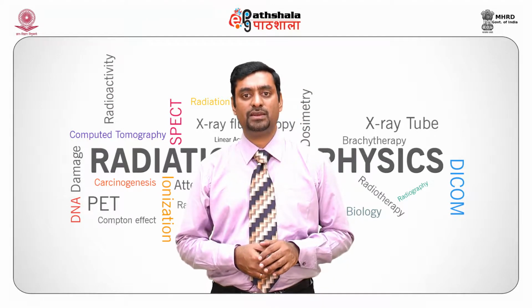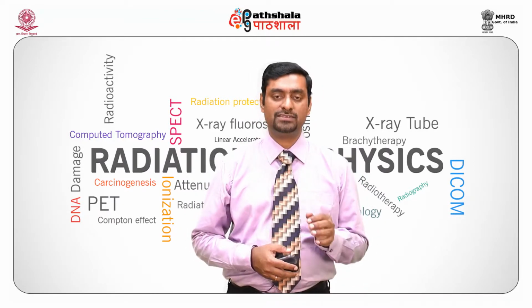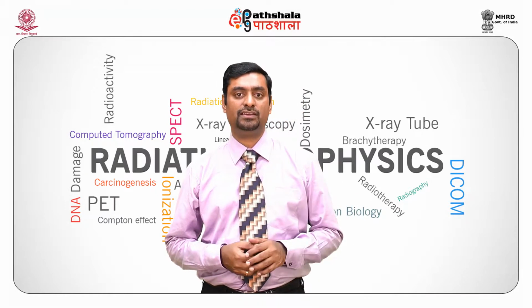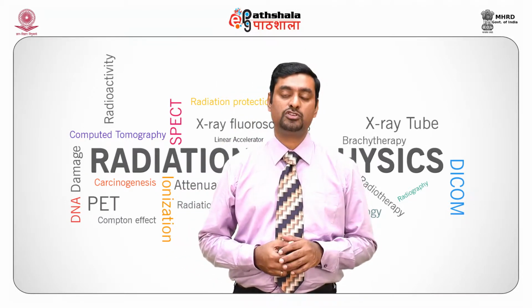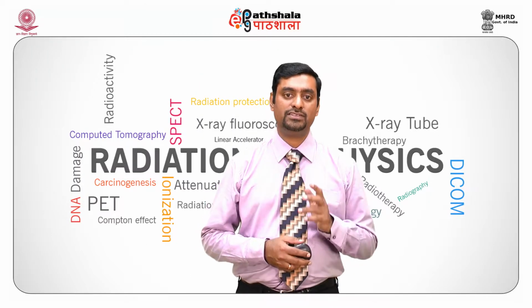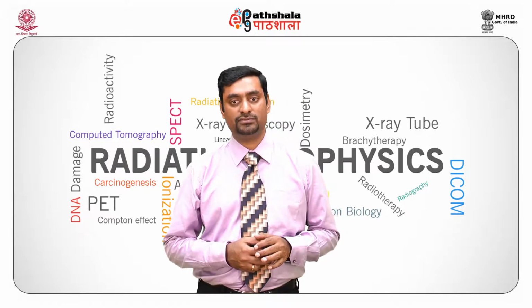Generally, single-sided emulsion coated films are used for mammography purposes. The cassettes that are used for mammography have a single-sided intensifying screen with an absorptive base. The films can be identified with a notch on the right hand side of the film, as seen in this illustration. The advantage of film screen receptor is that it has high spatial resolution.